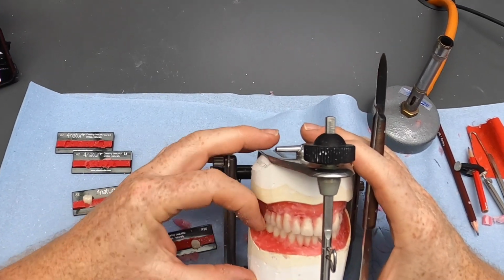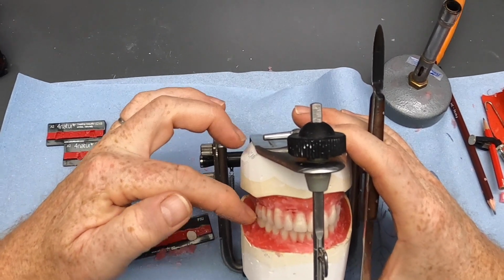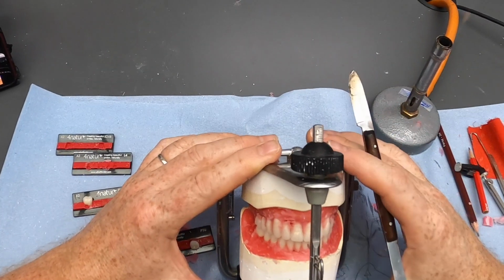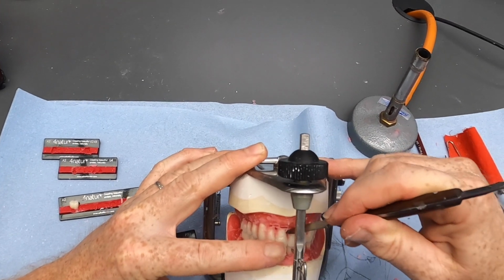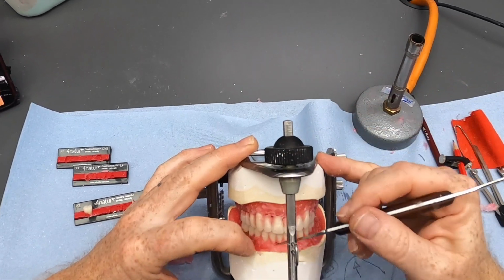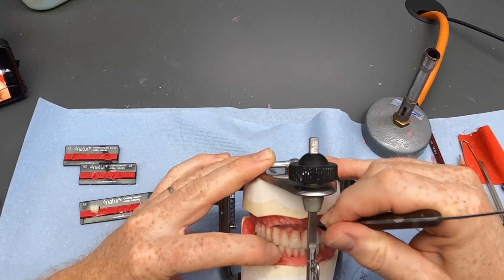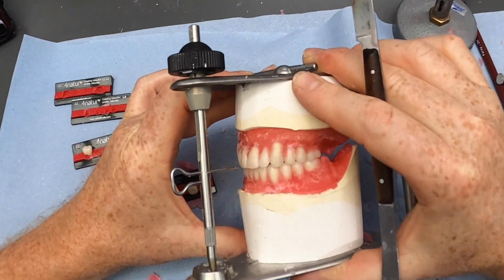So at the moment we've got the palatal cusp going into the central fossa. We could move the upper tooth in quite a way and get the buccal cusp going into the central fossa, or we can flatten off the teeth and have the teeth biting cusp to cusp. We're just a little bit skew on the front here as well, so I was just doing a few tweaks to these. This patient's right looks a little bit higher than the patient's left, so I'm just doing a bit of fettling as we go. But essentially we've got all the teeth in the right place now.